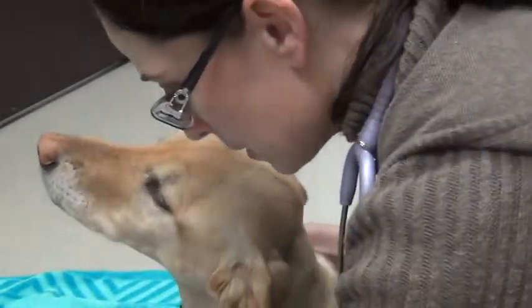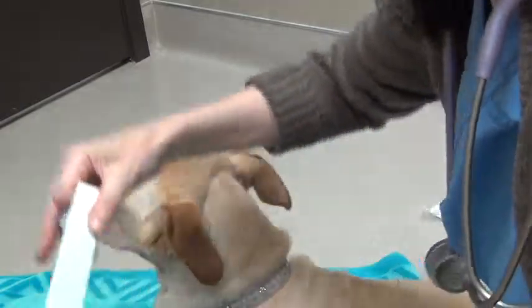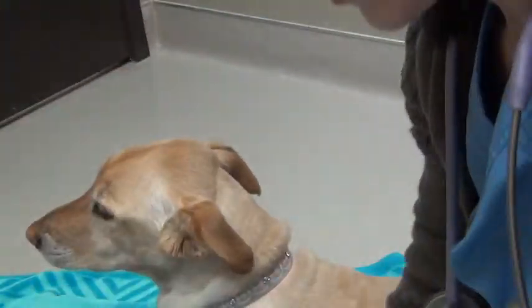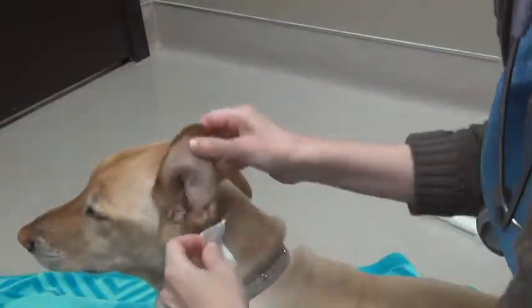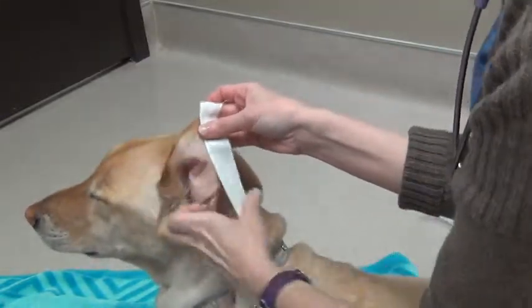Hey, sweet girl. So we're going to start off by making stirrups for the ears. I'm going to need 4 pieces of the 1 inch porous tape. This is going to go on the outside of the ear, and this will fashion the ear up on the head. So we're going to go ahead and do it like this. Come to the outside of the ear.